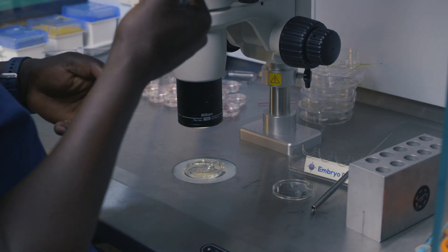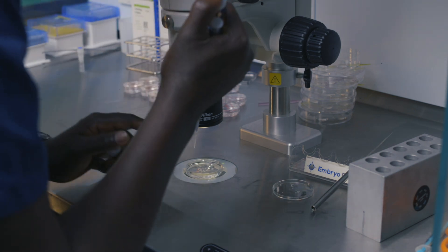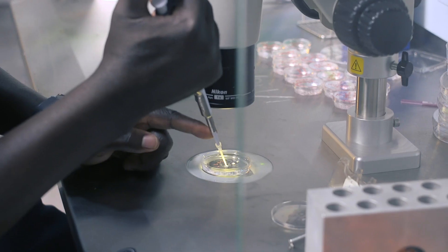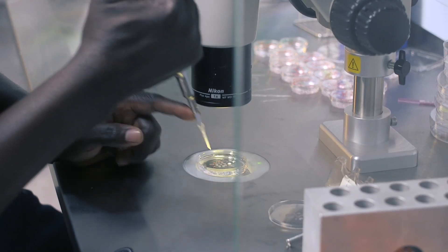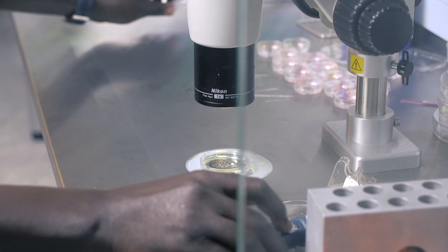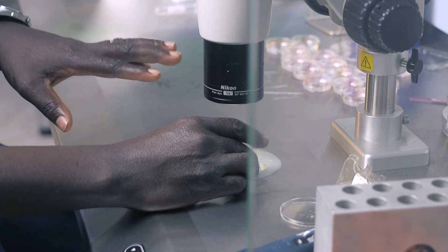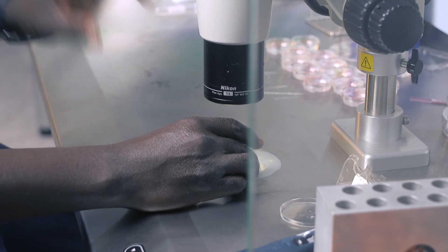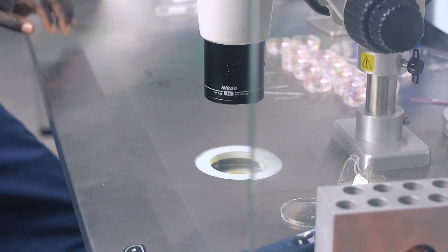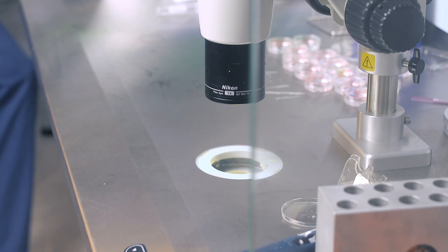I add a sperm sample which I'm going to inject into the eggs. Now I have my sperm and my eggs, so now I have to go and do the injection.